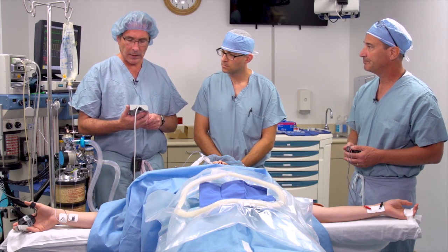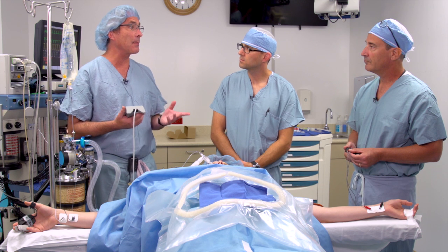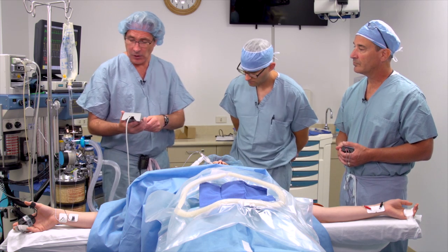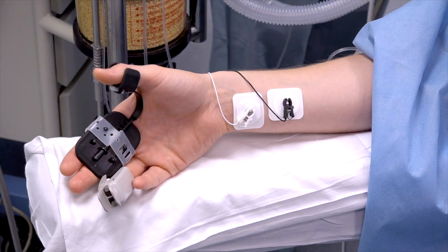Glenn, how do we look over there? Now, we need to check this. Many patients will recover to a train of four ratio of 0.9 or greater after 20 minutes, but many may not. The only way we're going to be able to reliably determine is using quantitative monitoring like a TOF-Watch. We're going to turn this on and track our train of four ratio — four good twitches and a train of four ratio of 1.08. This patient is recovered. At this point we could safely extubate the patient and assume recovery of pharyngeal and airway protective muscles.